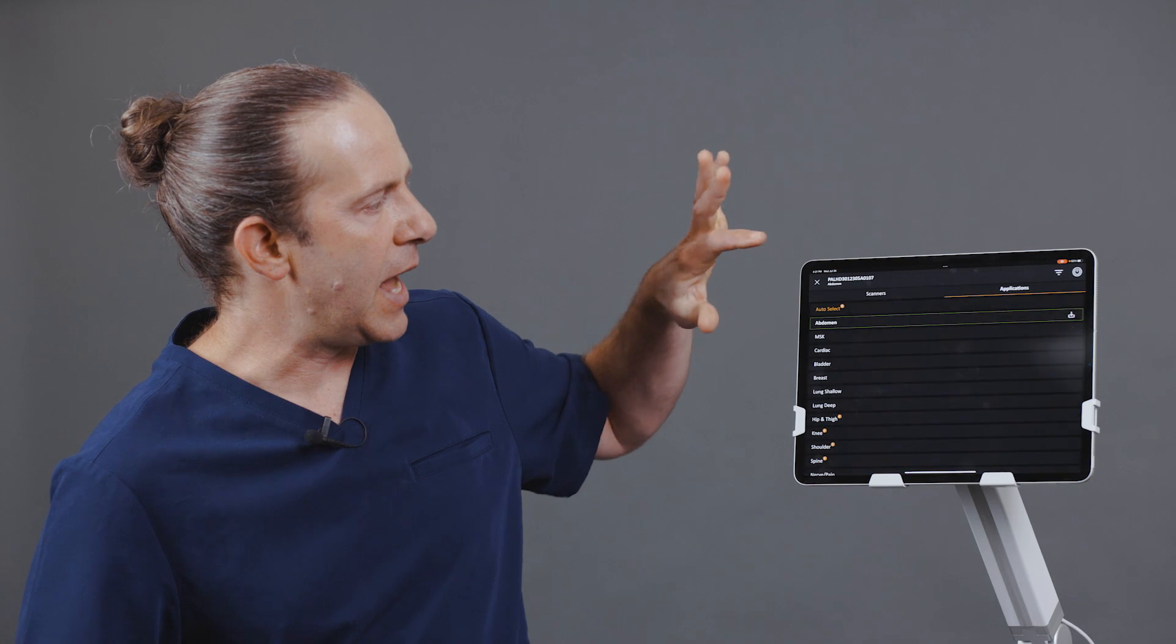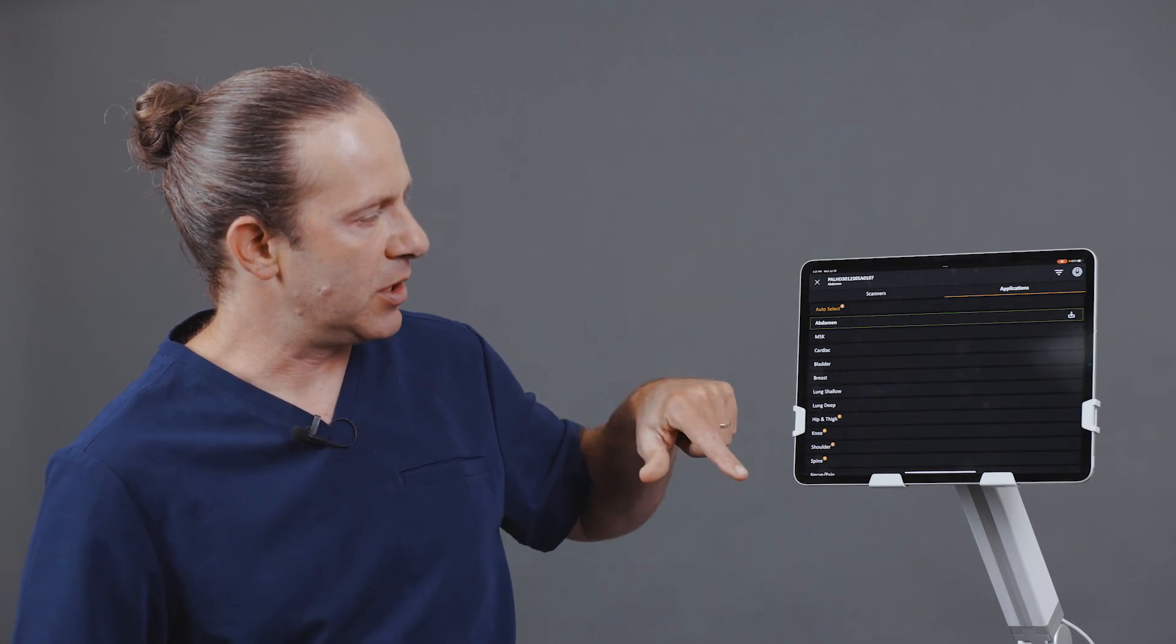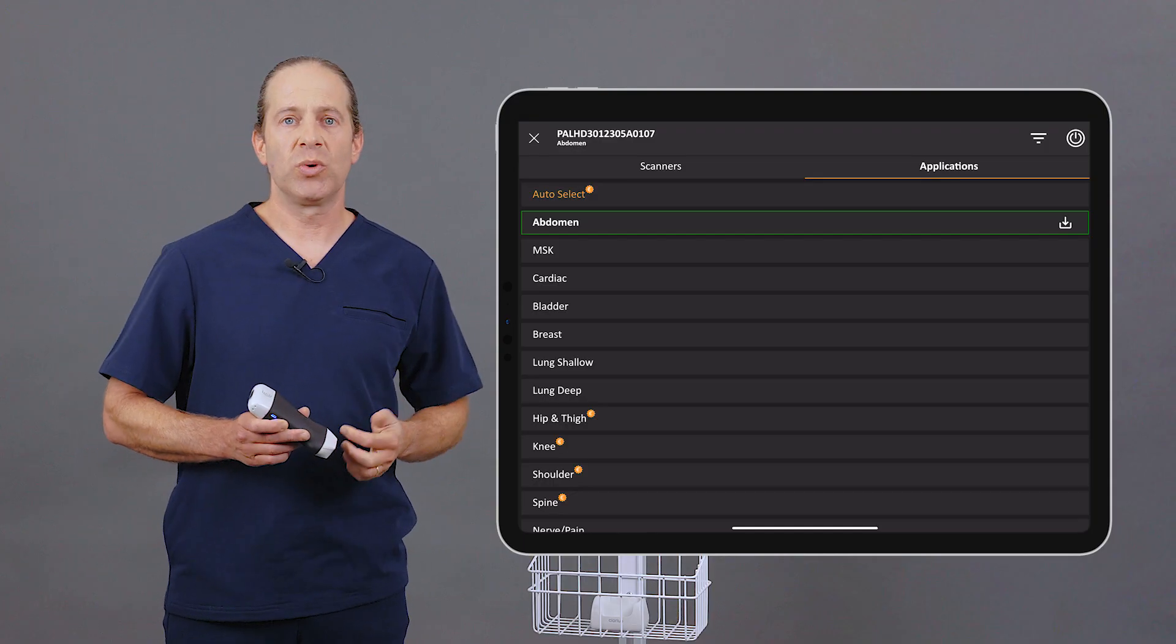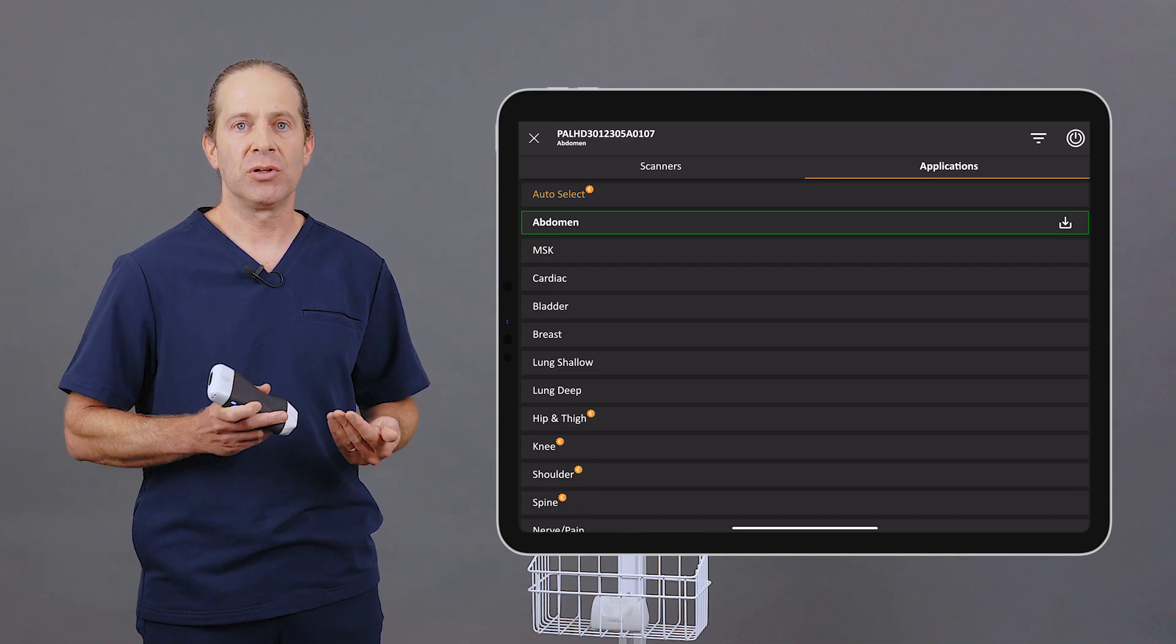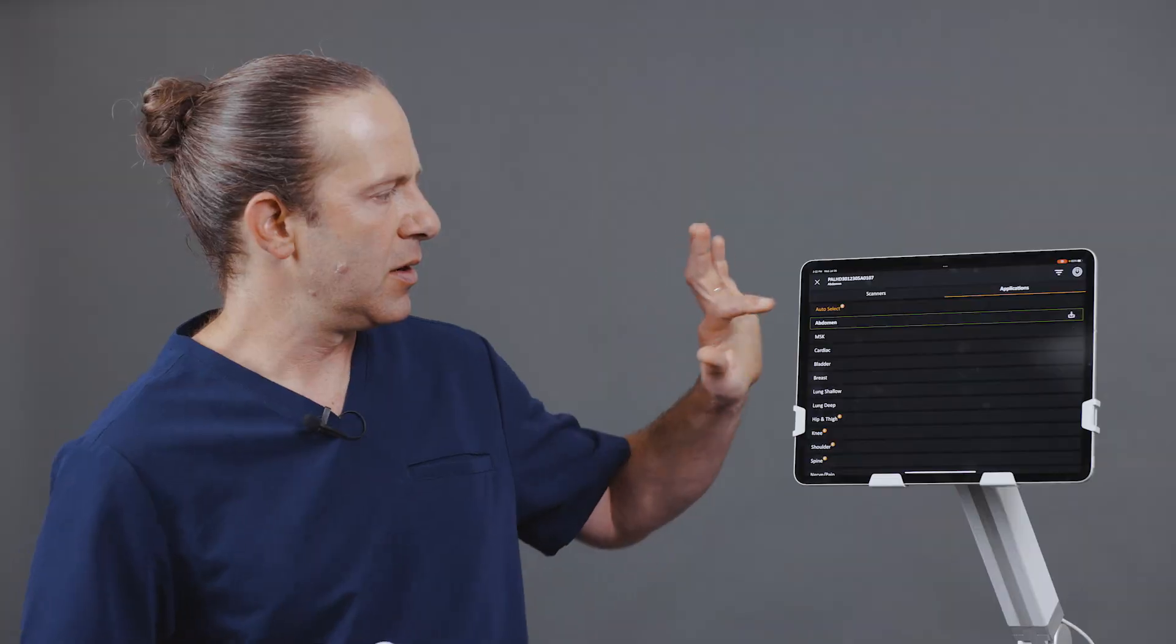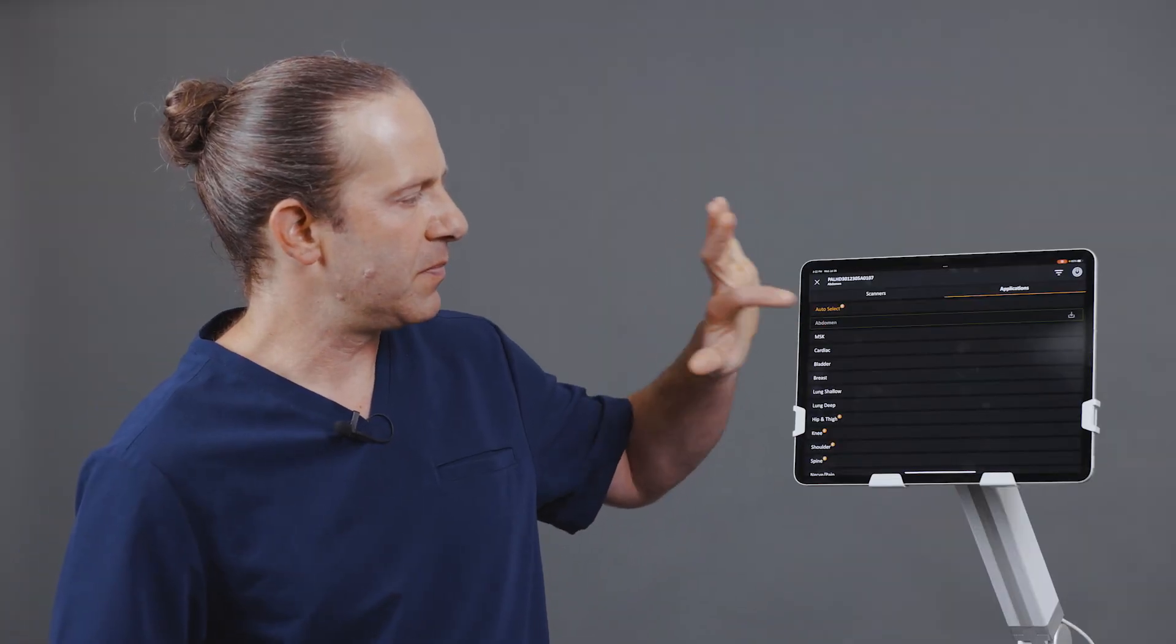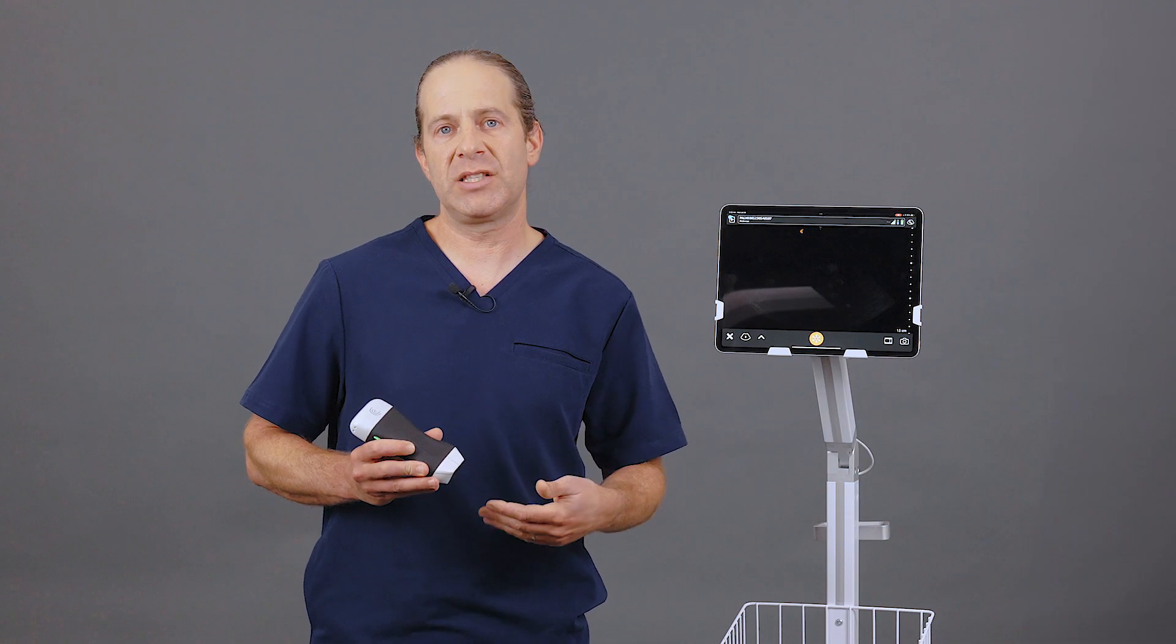Once the scanner is connected, we can go ahead and select our application. Different applications will default either to the Phased Array or the Linear Array, depending on what the optimal imaging strategy is. Here I'm going to select Abdomen, which is going to default to the Phased Array.